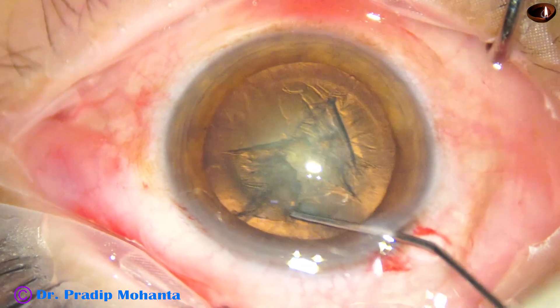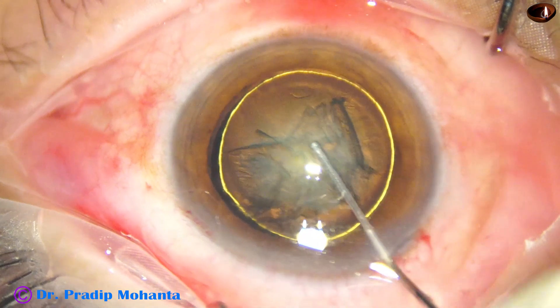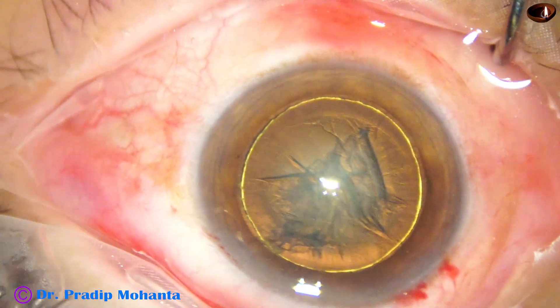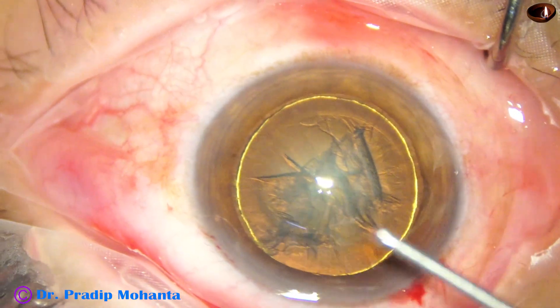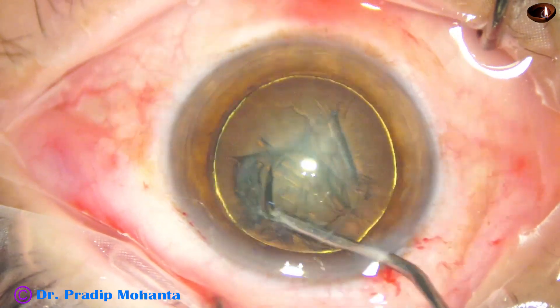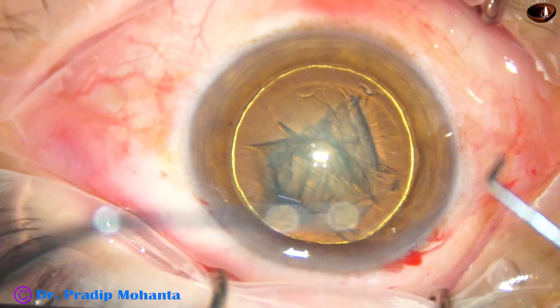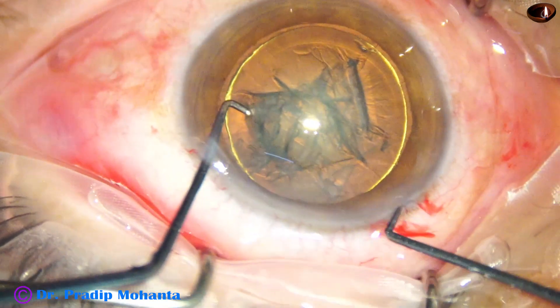We go to the other side and tap the nucleus. The fluid comes along the equator anteriorly, and then we inject fluid between the cortex and the nucleus. Hydrodelineation happens and we can see a beautiful golden ring in this case.